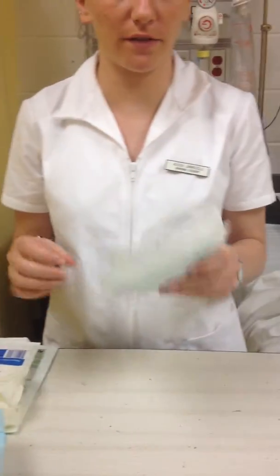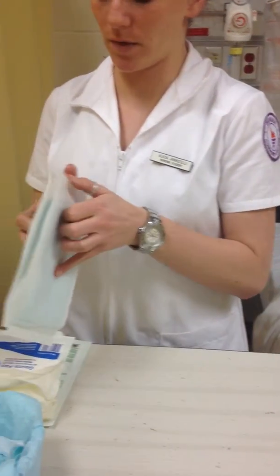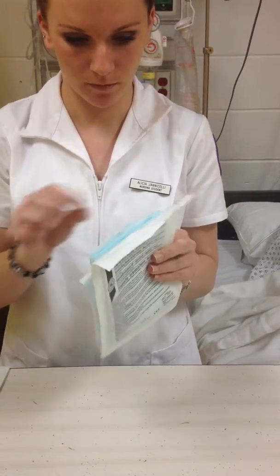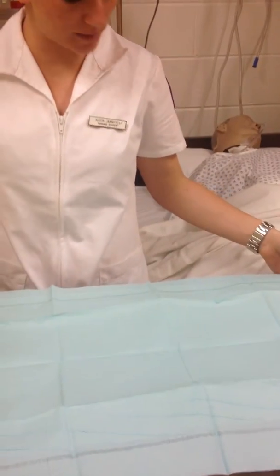We're going to check the expiration date of everything that we're using to make sure that it's okay to use, that everything we have is all right. Open this from the top. I'm going to have a one-inch perimeter around, which is going to be considered contaminated.